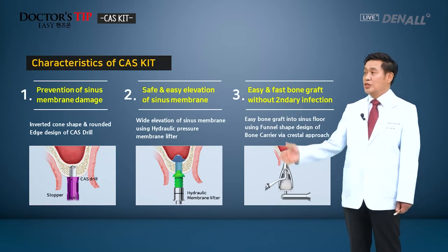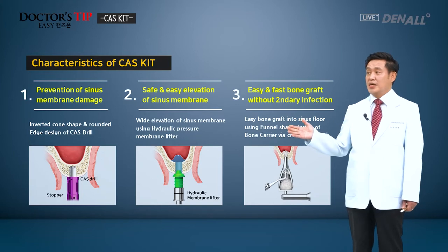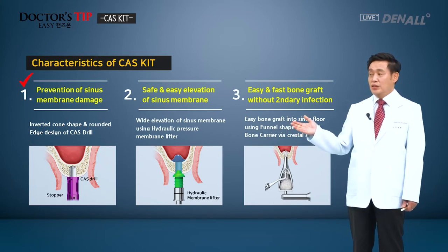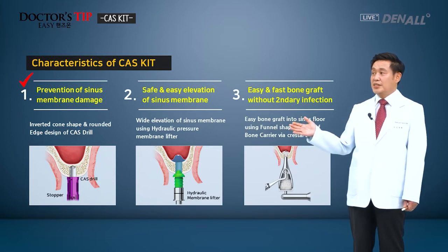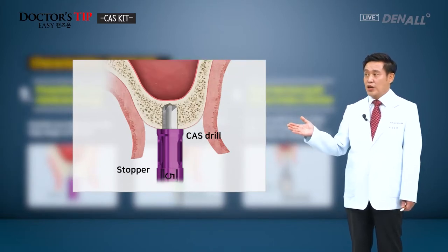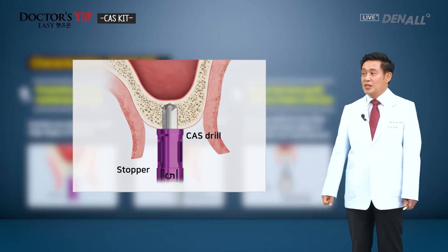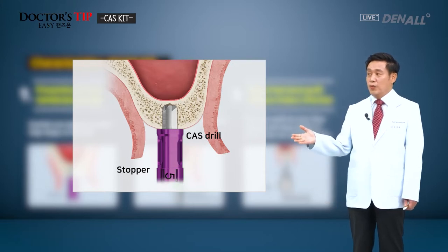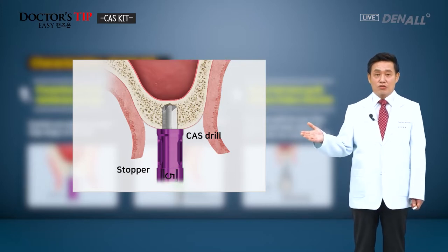Let's look at the characteristics of the CAS KIT. First, the top of the CAS drill itself has an inverted cone shape and the edge is rounded. So when you use the CAS drill, it minimizes the damage or perforation when you penetrate into the sinus floor. There's a stopper so that you can drill to the depth that you want.